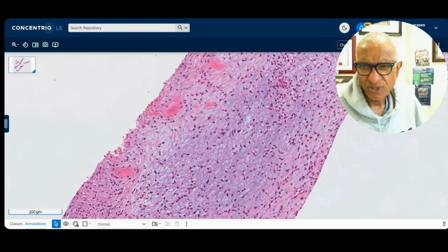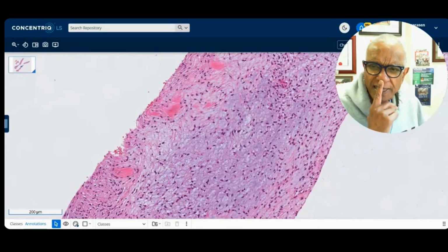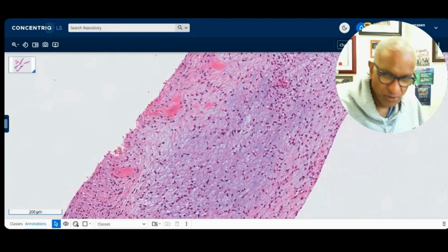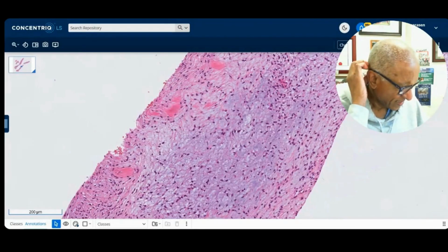Cells reaching out to hold hands. Yeah, that's chondromyxoid fibroma, Tiba. That's a good thought. They occur in bone, and they can form a surface mass as well. They can break through flat bone. You may argue shoulder, scapula. What's the radiology? Could this be a chondromyxoid fibroma? That's a very good thought.